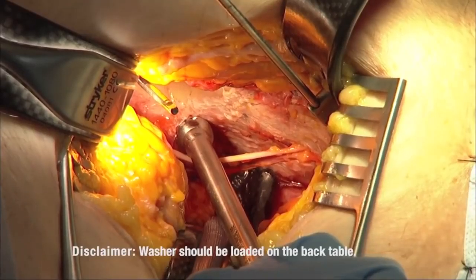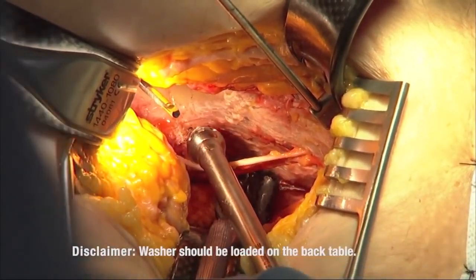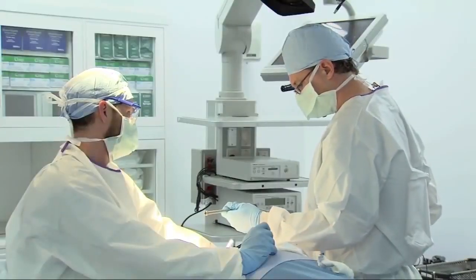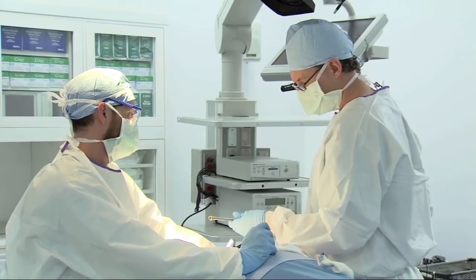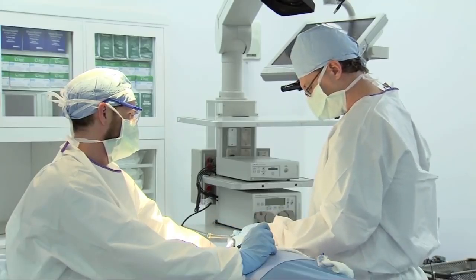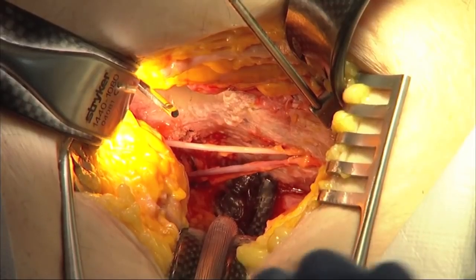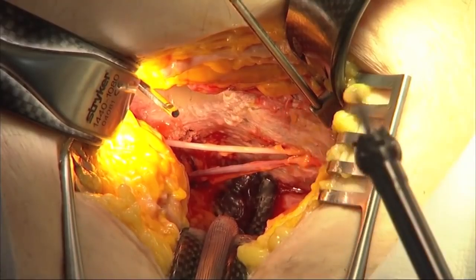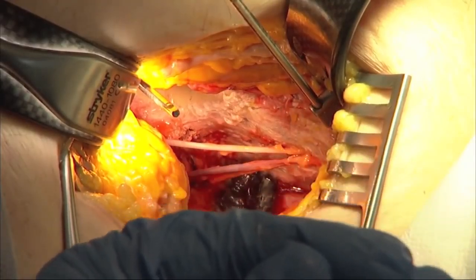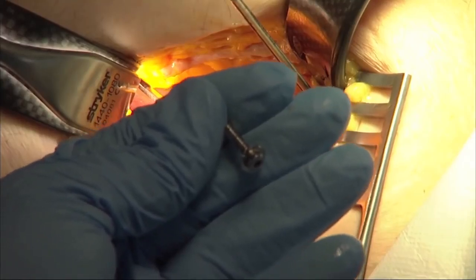The nice thing is that you can load a washer right into the spiked screw inserter, and the washer will sit right at the end of the spiked screw inserter so that when the screw comes down through the spiked screw inserter, it will deploy and take the washer with it all in one go.